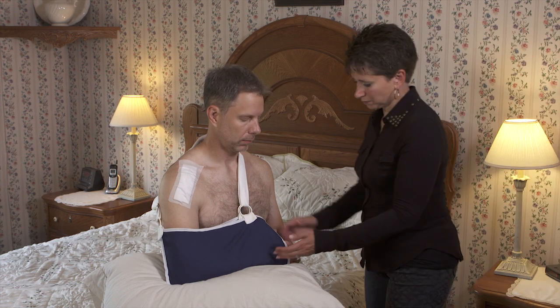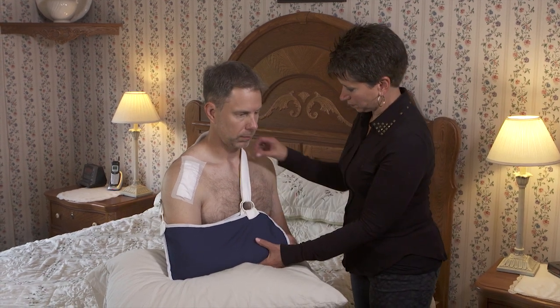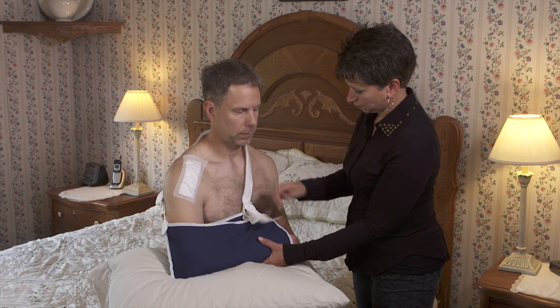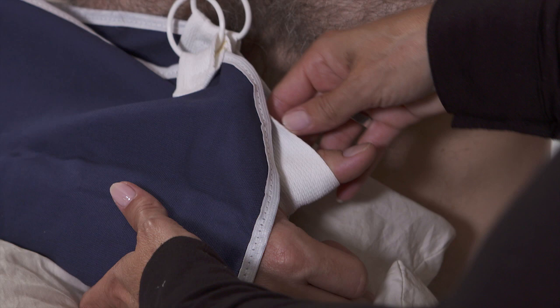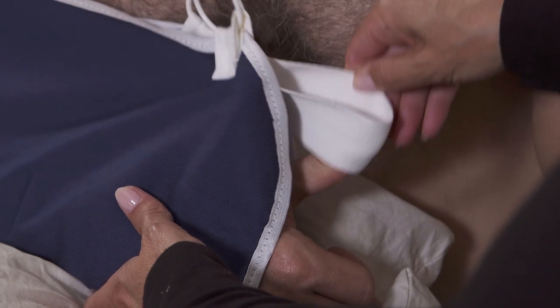After showering, sit on the edge of a bed or couch with your arm resting on pillows. Your helper puts a hand under your wrist to support your arm as he or she releases the Velcro on the shoulder strap and removes it from the rings. If your thumb is in the loop, your helper releases it.